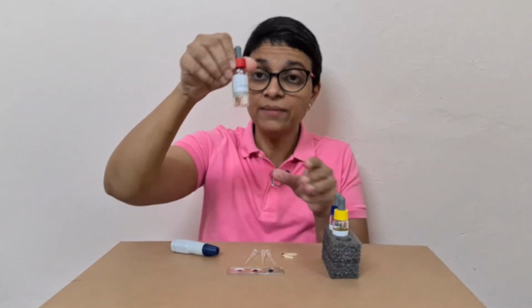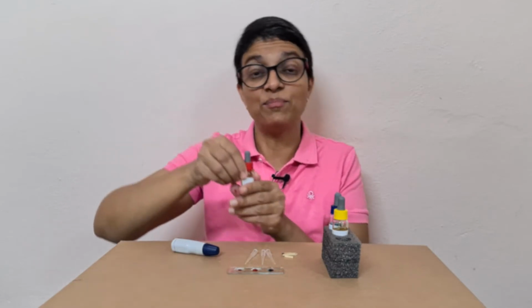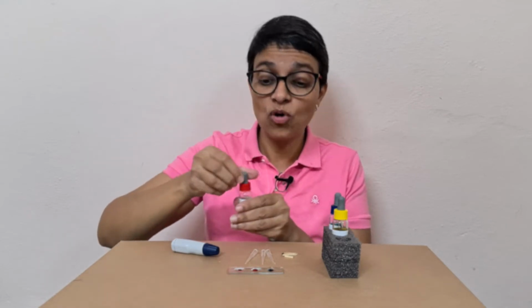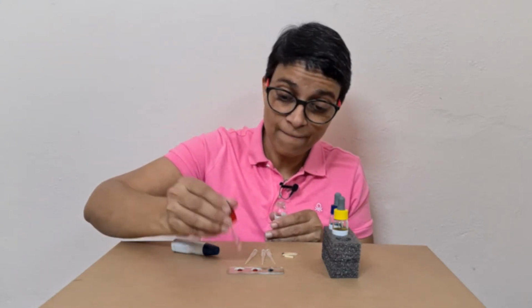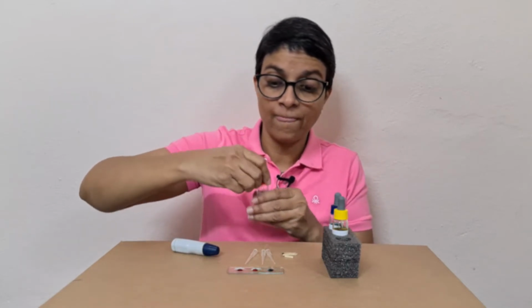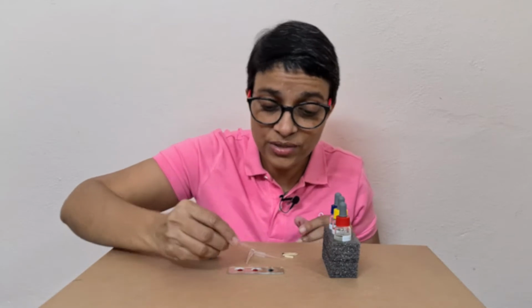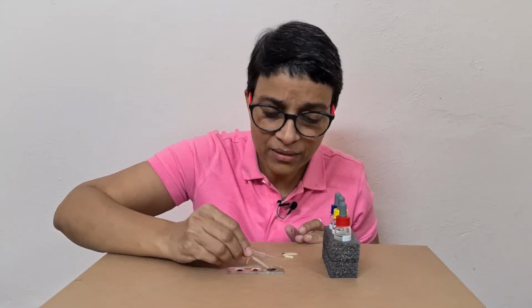And I'm also putting anti-D. These are the antibodies we are adding because the blood already has antigens. If we add antibody, we expect a hemagglutination reaction here. And once the agglutination reaction happens, we can see visible clumping.